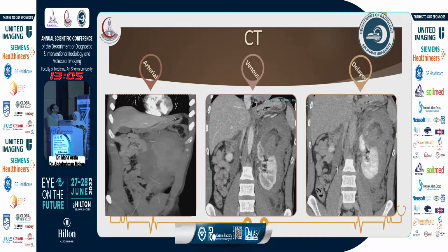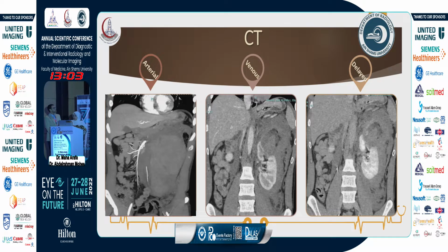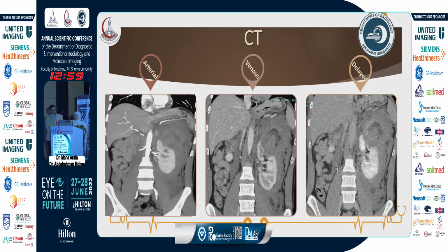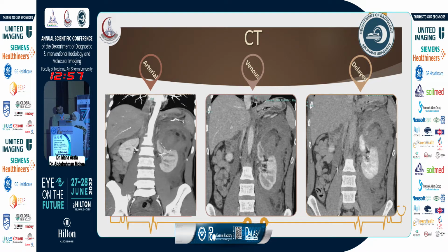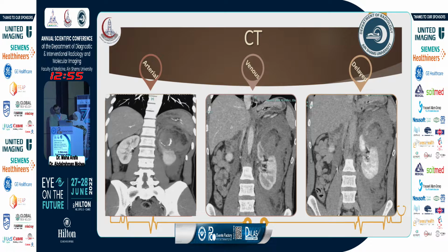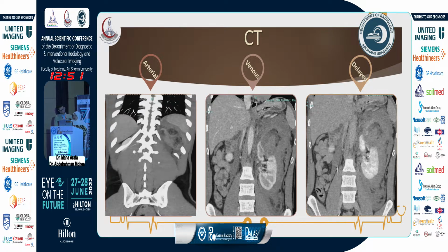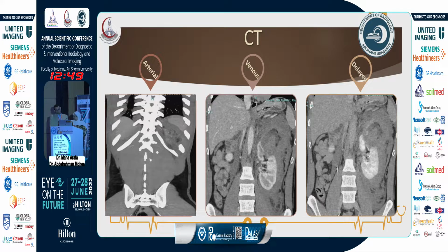In the first video, we are showing the arterial phase. There was direct extravasation and active bleeding from the superior branches of the renal artery. A hypertrophied left suprarenal artery is also noticed. And in the venous and delayed phases, the pathology was clearer, as a heterogeneous lesion with both fat density and blood density. Diagnosis was reached as a ruptured angiomyolipoma.